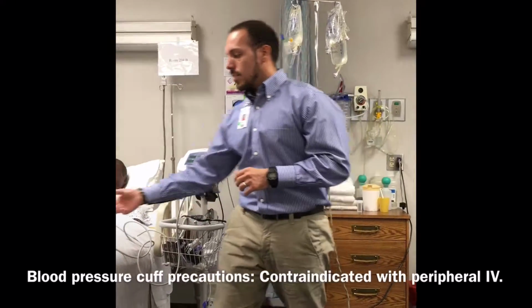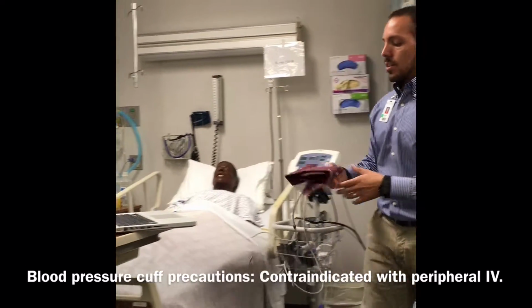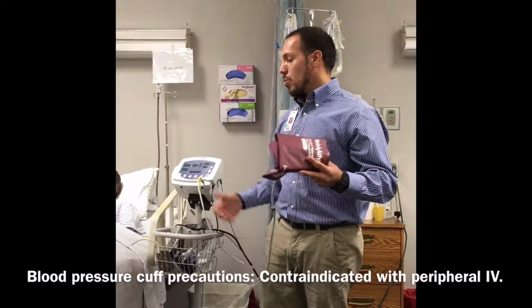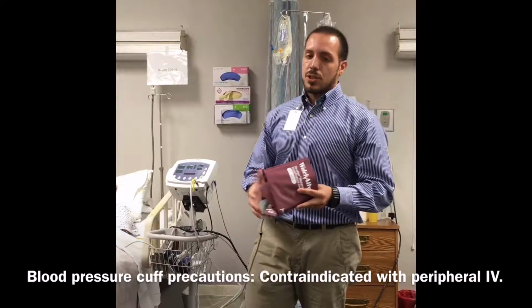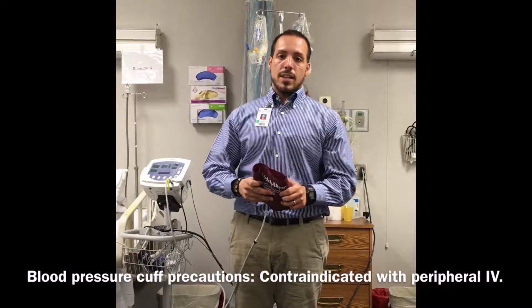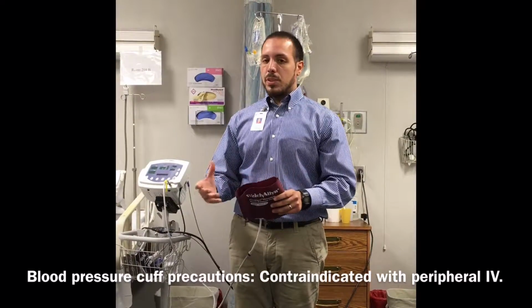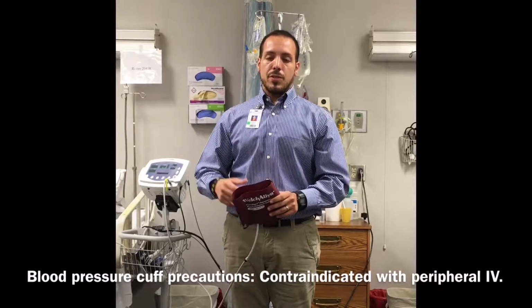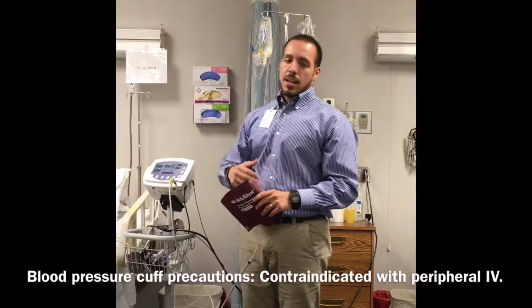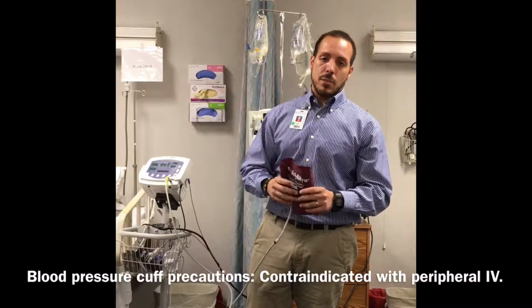Our next device is our blood pressure cuff. As you can see here, this is just an automatic one hooked up to our machine. The blood pressure, as we know, measures the systolic and diastolic pressure from the heart. You should be very familiar with the different cuff sounds if you do a manual, but this one is going to give you a direct reading, systolic on top, diastolic on the bottom.